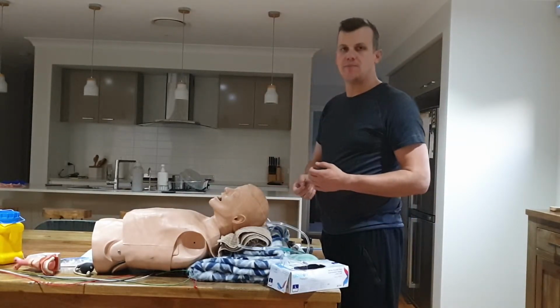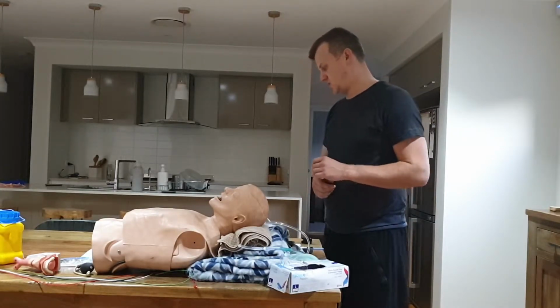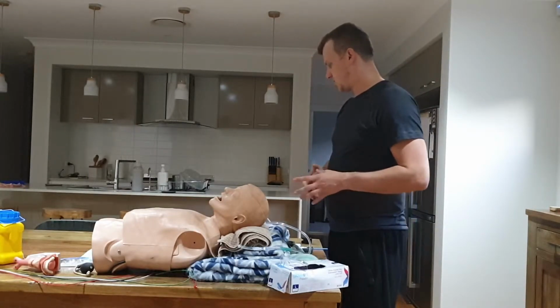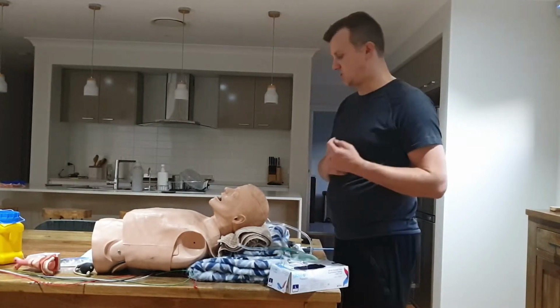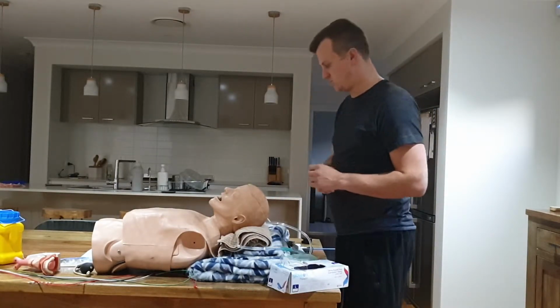Now, we use a 9 Ps method when discussing RSI. So you've got the plan, preparation, the protection of the cervical spine, the pre-oxygenation, the positioning, pre-treatment, paralysis and induction. Also confirming placement of the tube and post-intubation management.